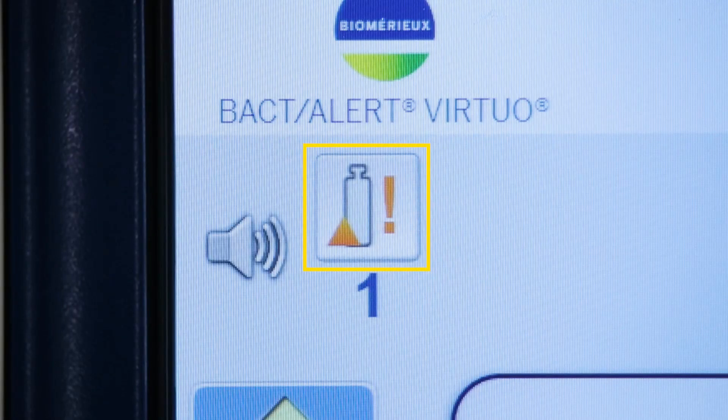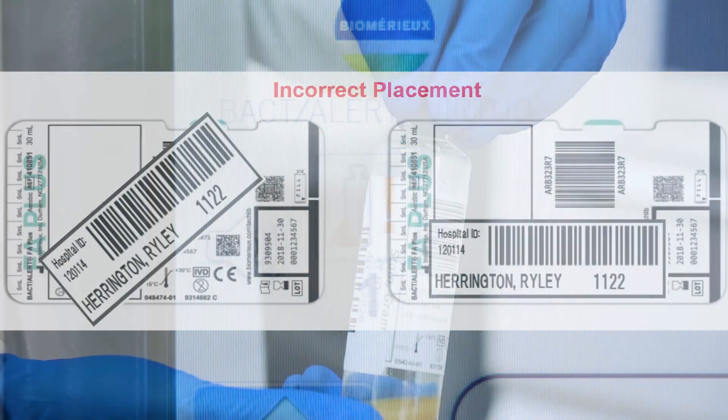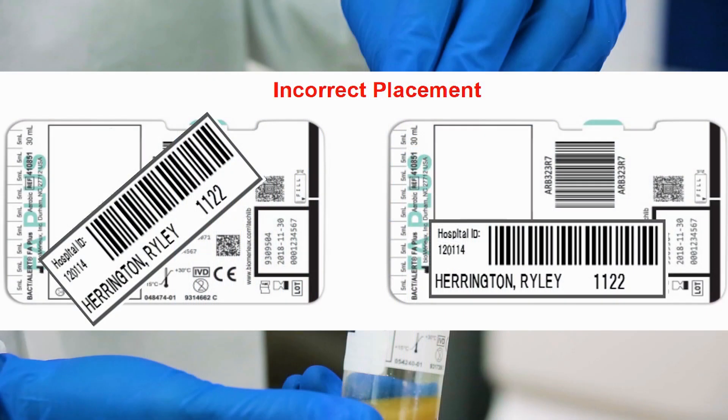An alert for an orphan bottle will appear on the BactiAlert Virtuo system if an accession ID is not assigned for the bottle. This is often caused by an issue with user-applied labels which were unable to be read by the barcode reader during loading.